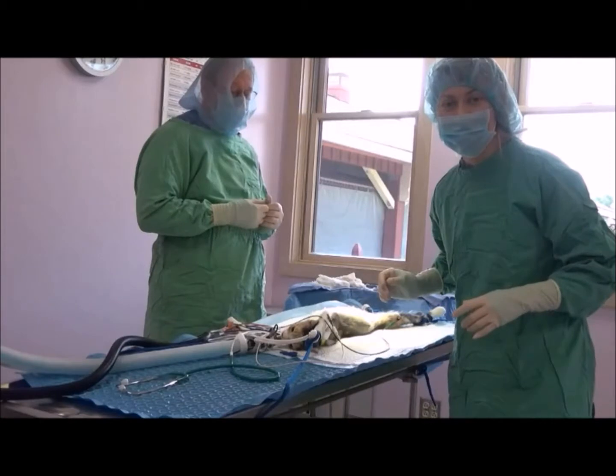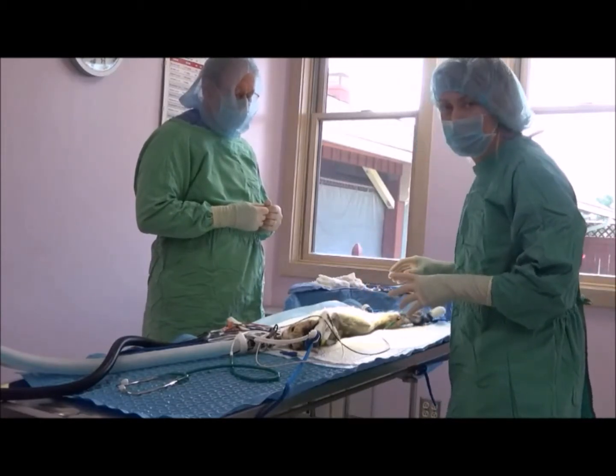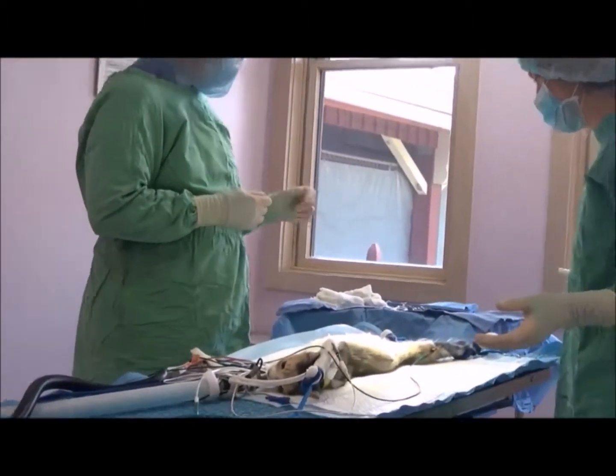I've completed the non-sterile prep for our feline spay, and we brought her into the surgical suite. So now we'll begin our surgical prep before completing the spay.